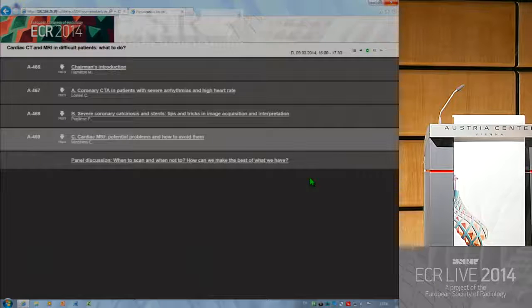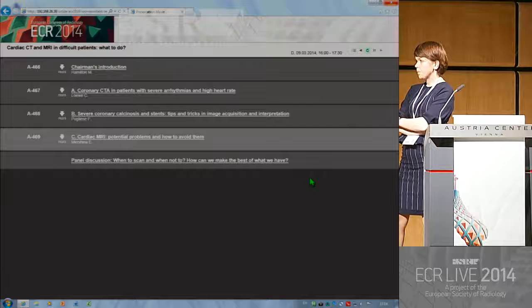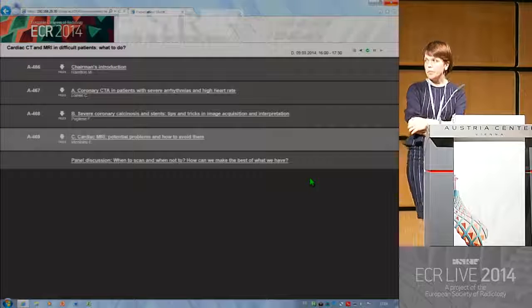What I'd quite like to ask, actually, and this is for people who are going to start doing delayed enhancement, because it's quite a nice way to start doing cardiac MRI. Do you have a standard dose that you give the patient, and then a standard time you wait, and then a standard inversion time you use to get started for people not familiar?